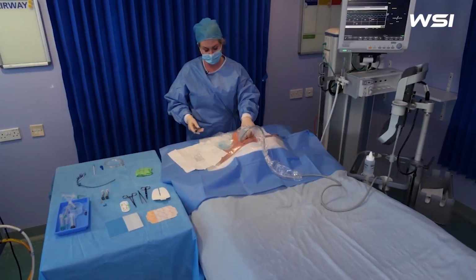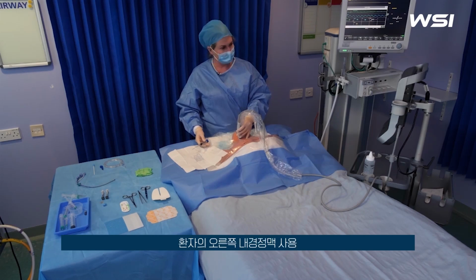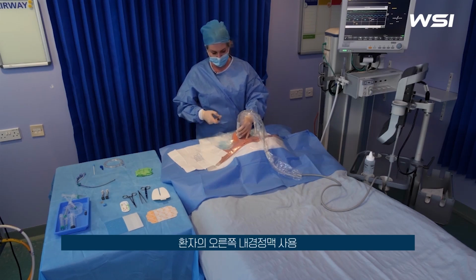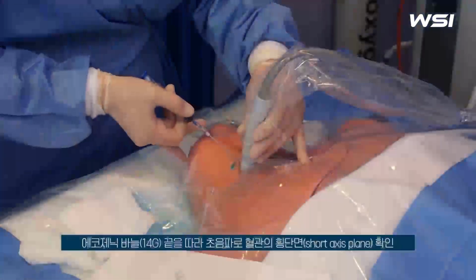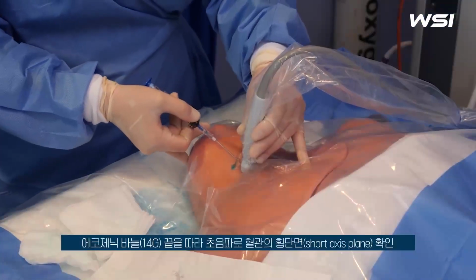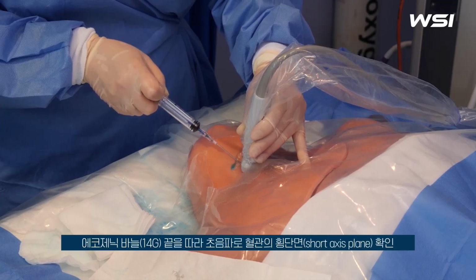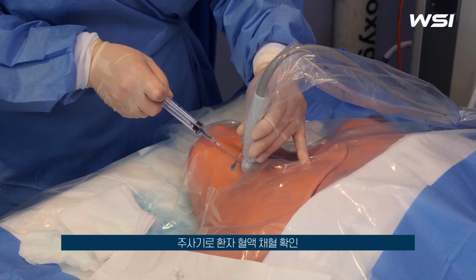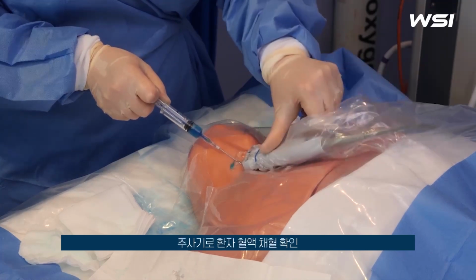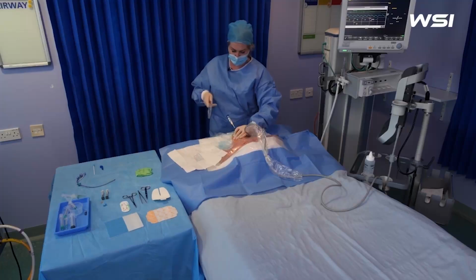Okay, so we're going to insert now into the torso and right internal jugular. I'll try and talk you through it as best as I can. I'm going to use the short axis plane initially, following the tip of the echogenic needle, so you can see it all the time and aspirating as we go. Now it's a closed system, so we don't need to take anything off there.